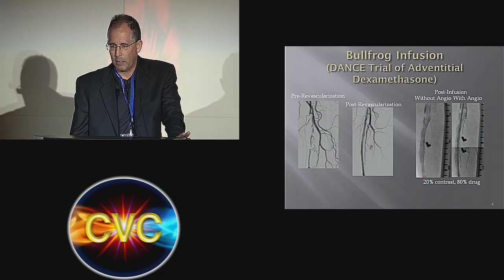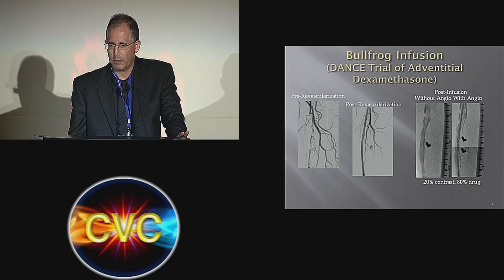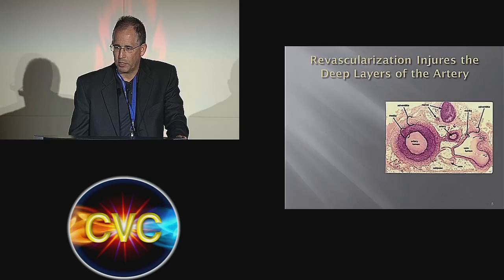Here is an illustration of diseased SFA, then the next image is the revascularization, followed by the administration of dexamethasone, and then finally the final image after administration of the drug.